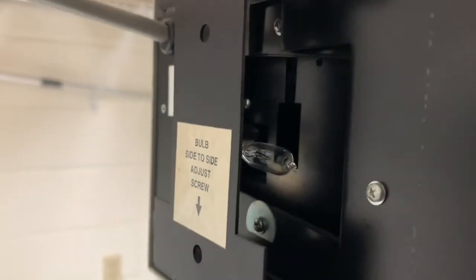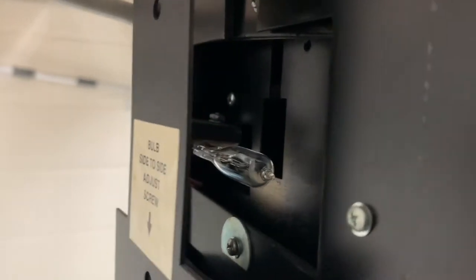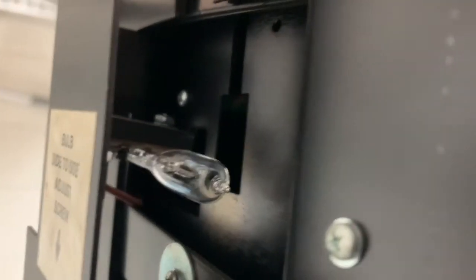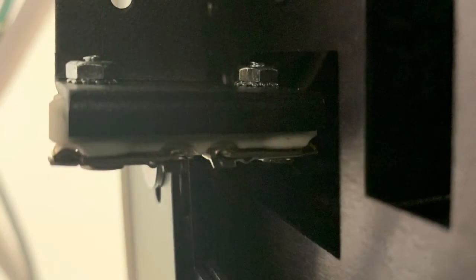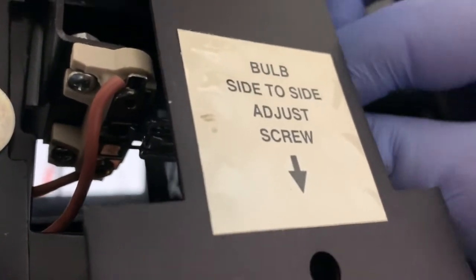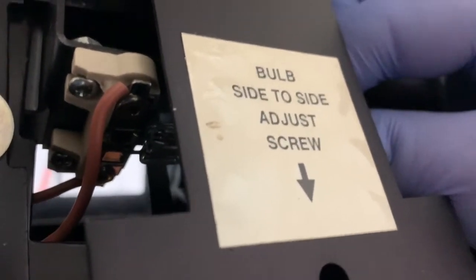With the cover removed, you'll find the bulb back behind this plate. To install the new bulb, you need to push those prongs into these small sockets here. Make sure you push the bulb all the way in and it's seated properly.